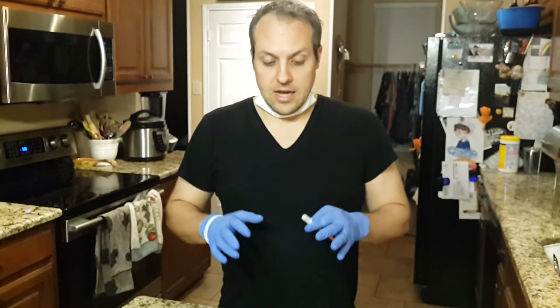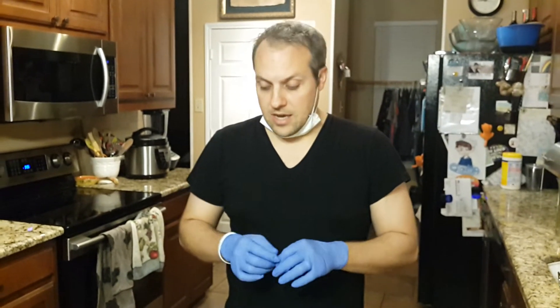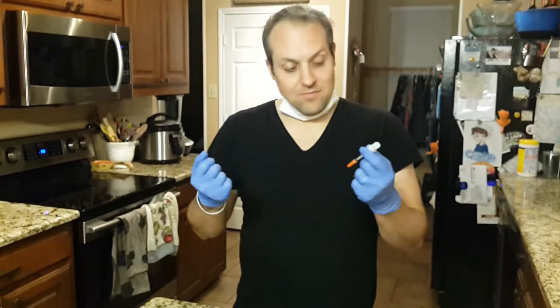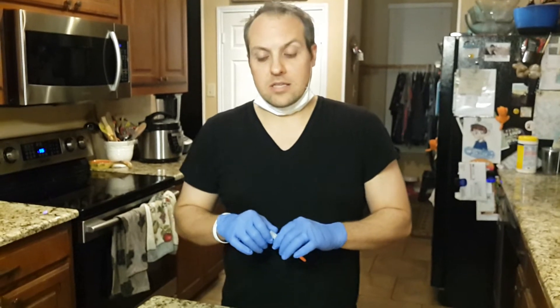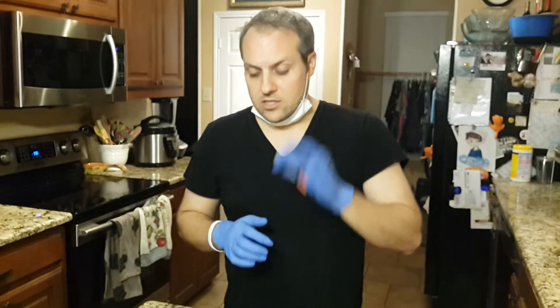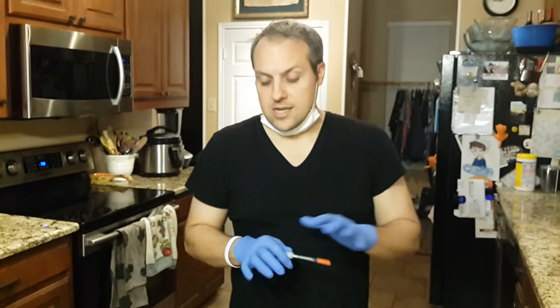You want to be as sterile as possible — whatever disinfectants you have at home, wipe up. Get some sterile gloves; these aren't the sterile ones I have to admit, but you want to get a surgical pair that open up with no powder in them — nothing that's going to get in the way of the Kineret. You want to use a face mask too. I've had some flu the last two weeks so I definitely try to put a face mask on every time. I do this process every three days.